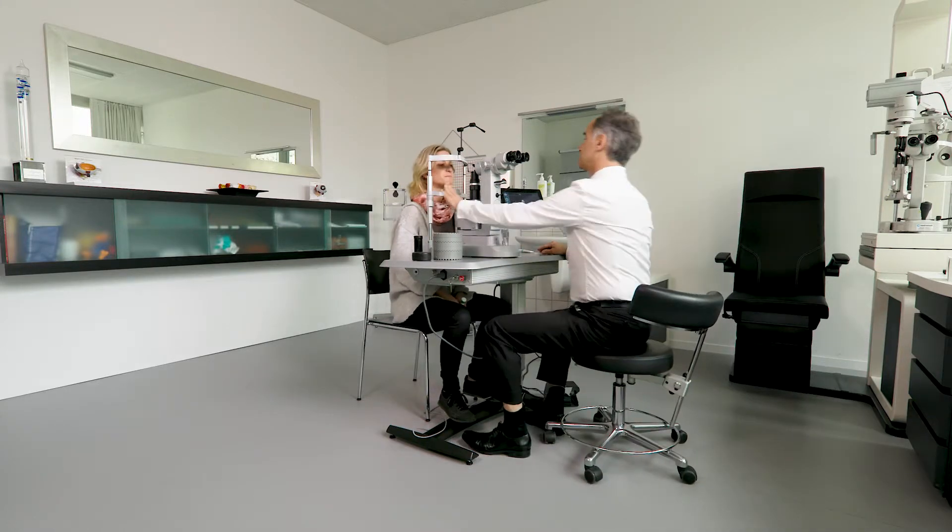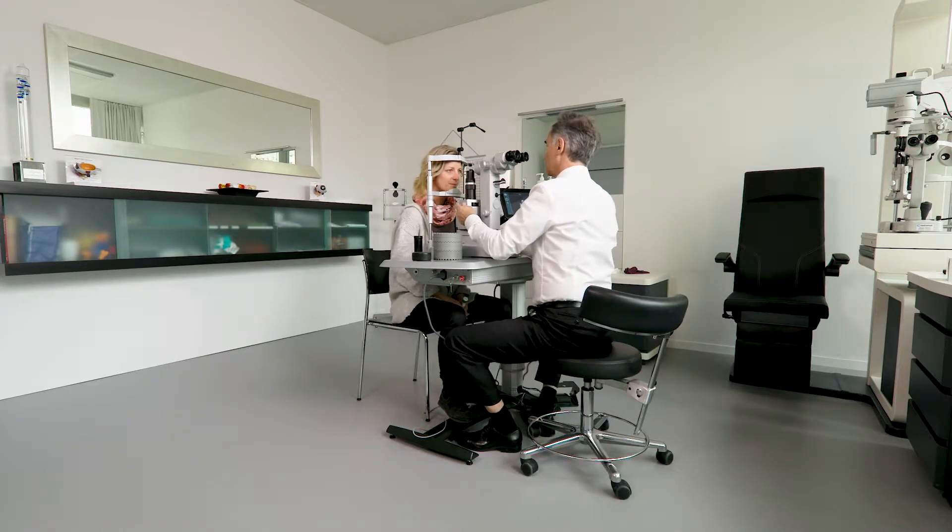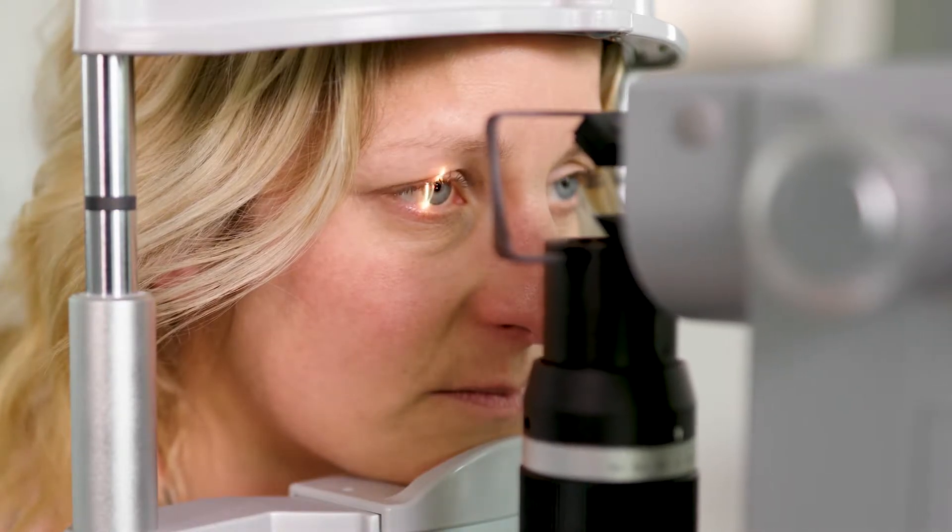We looked for an efficient treatment of macular pathology, a chronic disease, and found the 2RT from the Australian company ELEX.